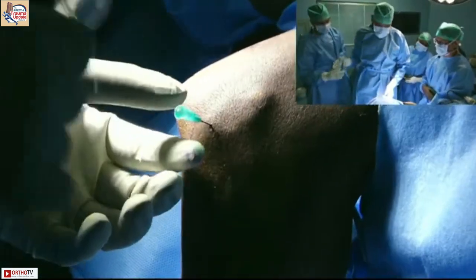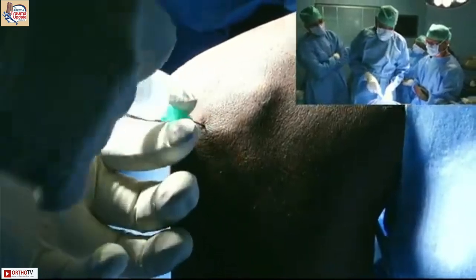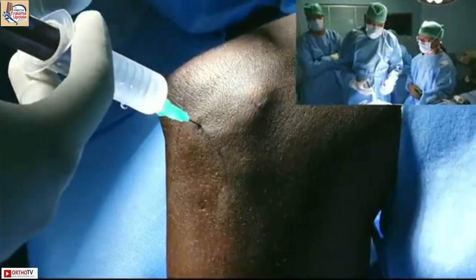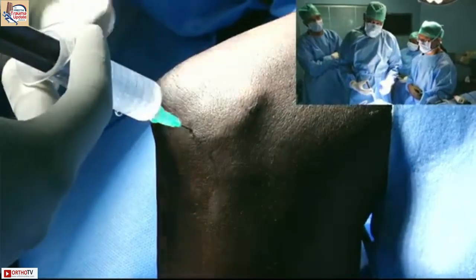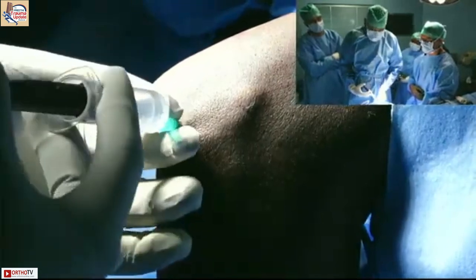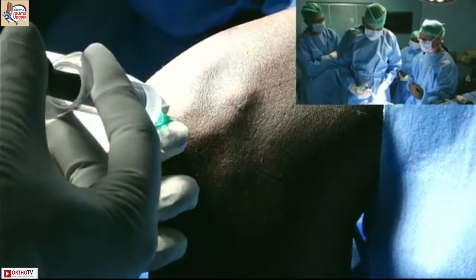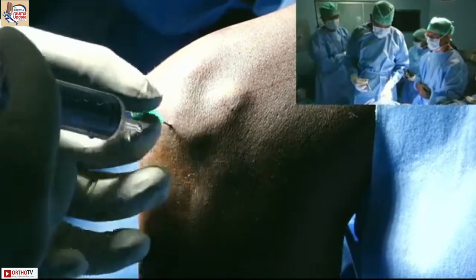One of the most important things to understand is that with insufflation of the joint, you're creating a working space, but it does not increase the distance between the anterior structures, the neurovascular structures, and the capsule. So you've got to be very careful from that perspective. Okay? Okay, got it. That's it. So that is the joint nicely insufflated.